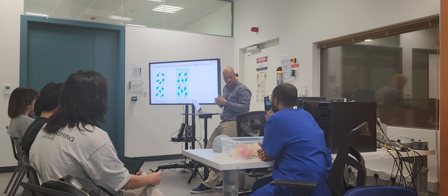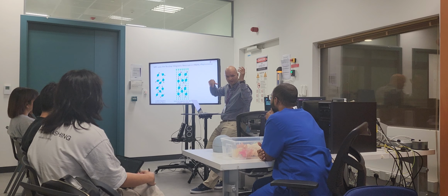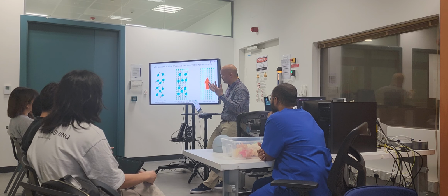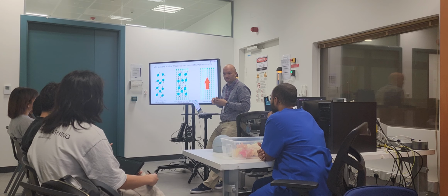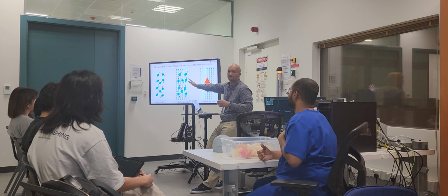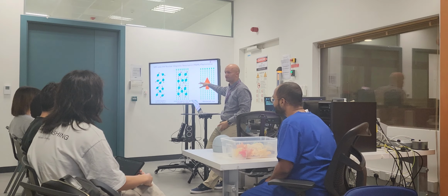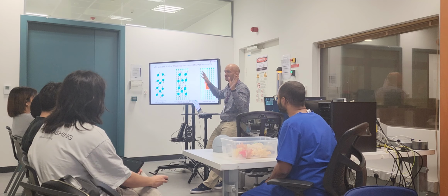And maybe you derived Zeeman splitting and all that, with some quantum equations that make no sense to me, you end up with a spin. You end up with a magnetization vector. Everything before this is quantum mechanical phenomena. But we can describe this magnetization vector with classical physics.